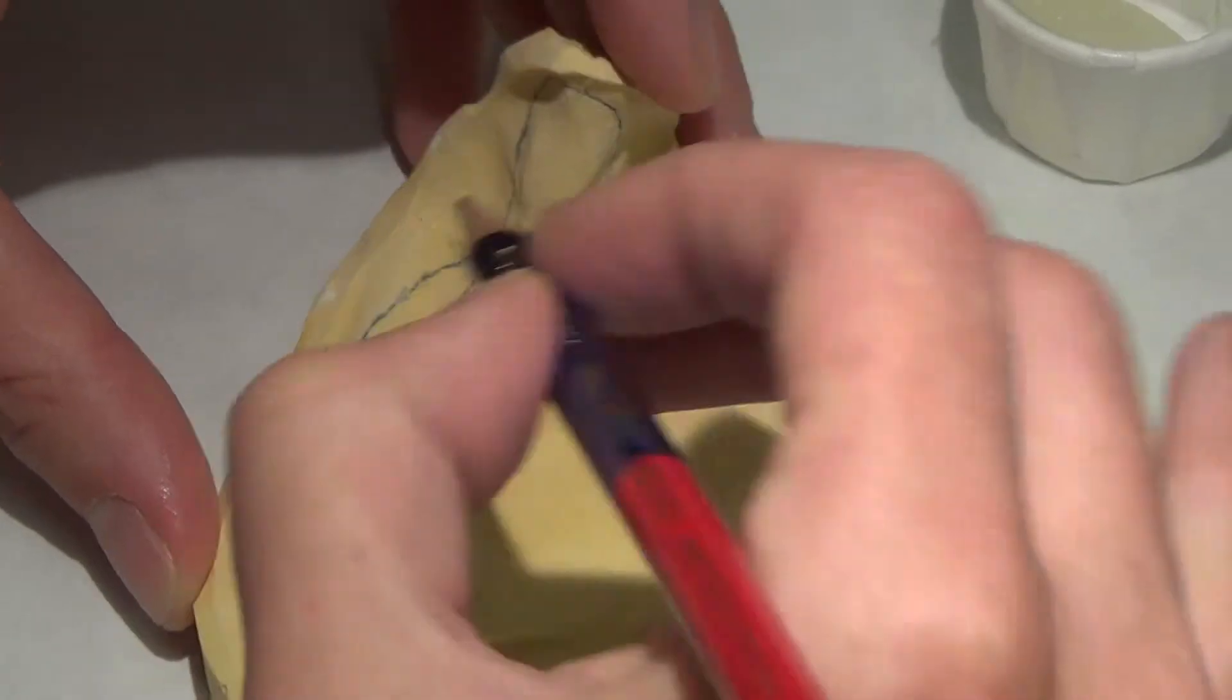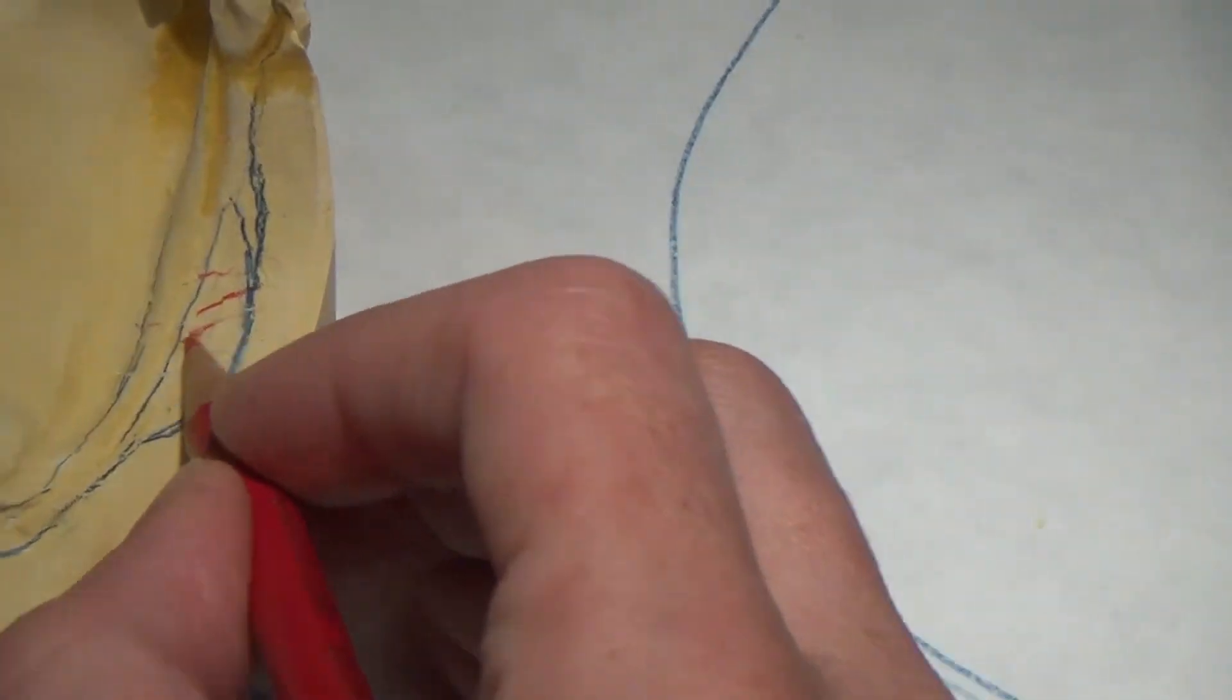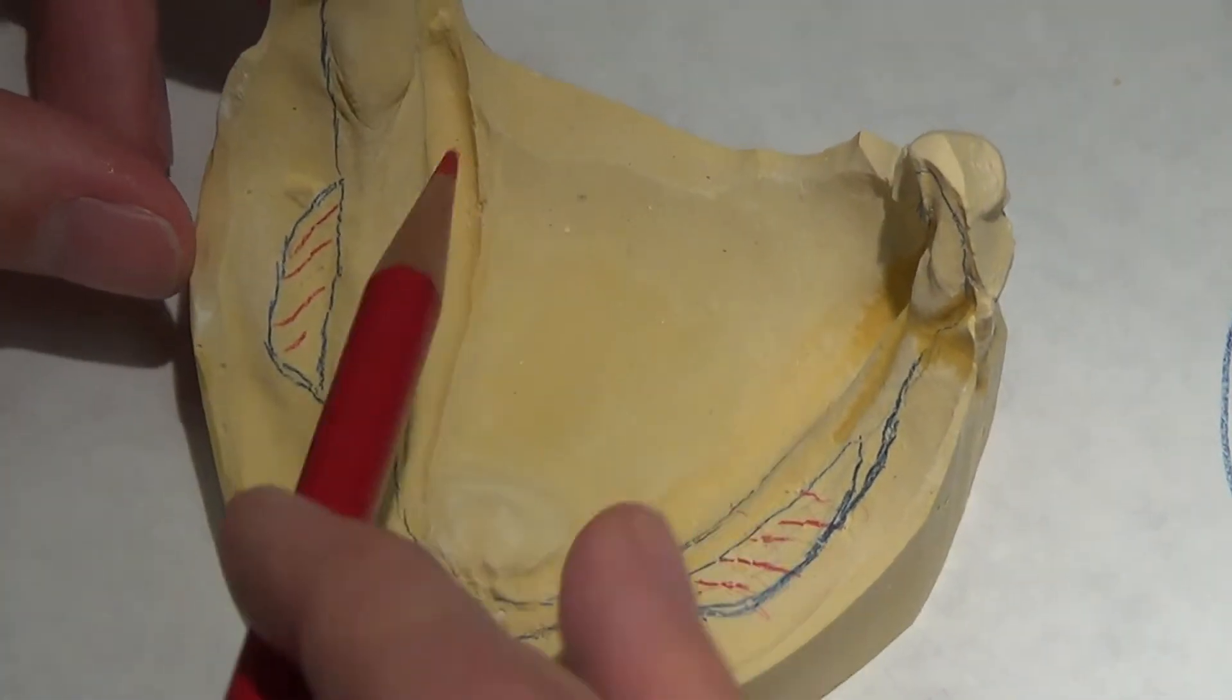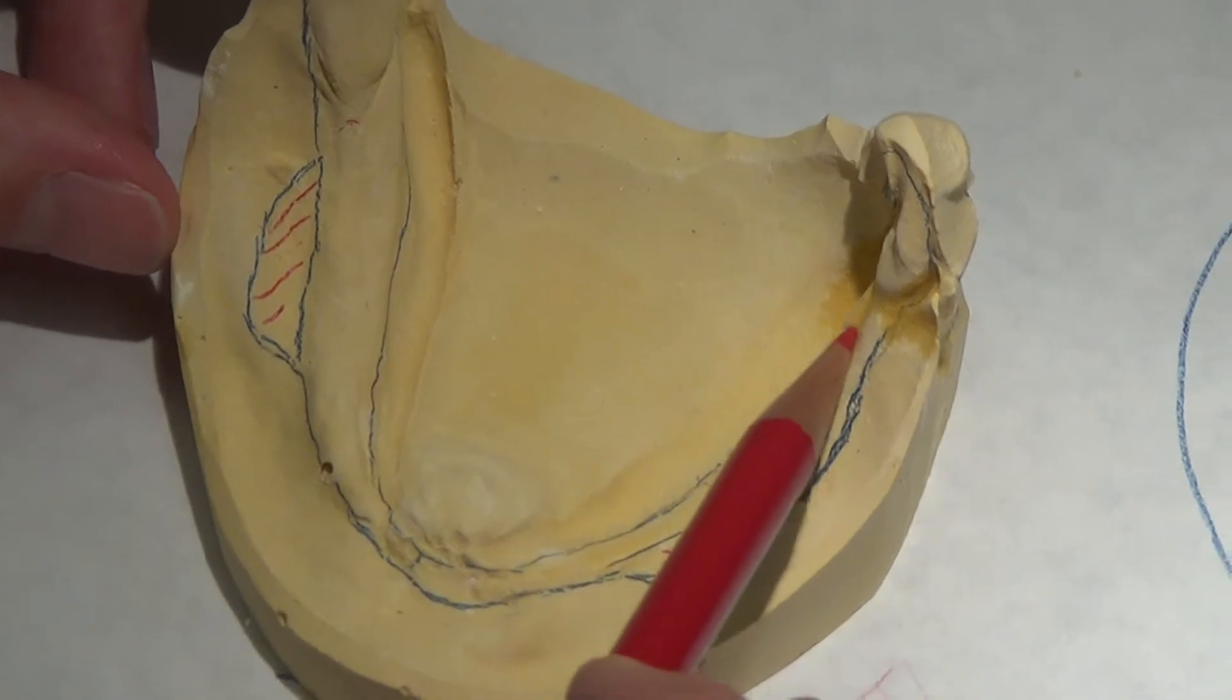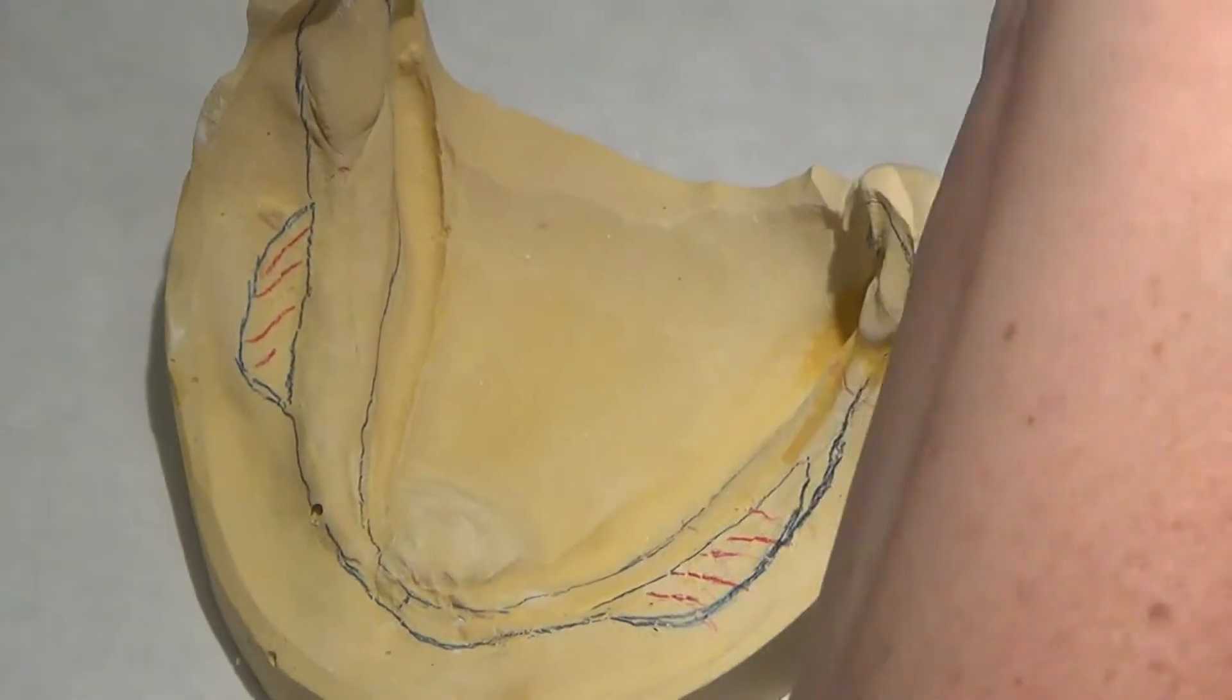Now this area here and this area here are going to be my bucket shelves. That's where my stops are going to go. And I'm going to make sure I extend my handle high and all the way around. You'll see that as we go forward.